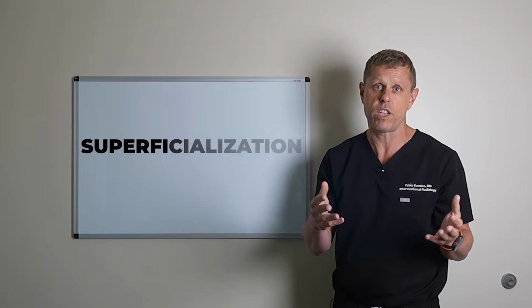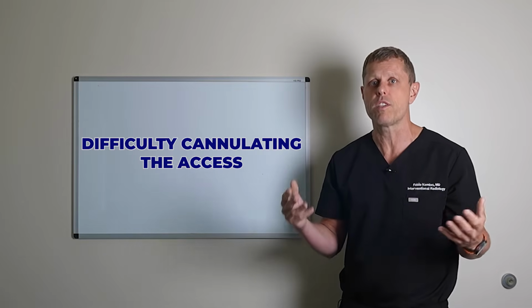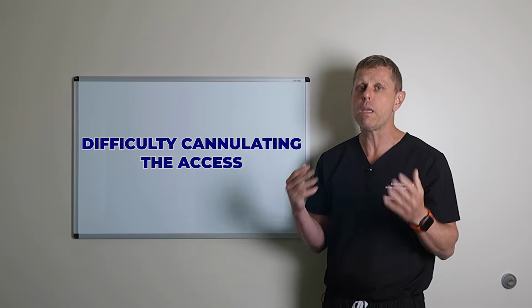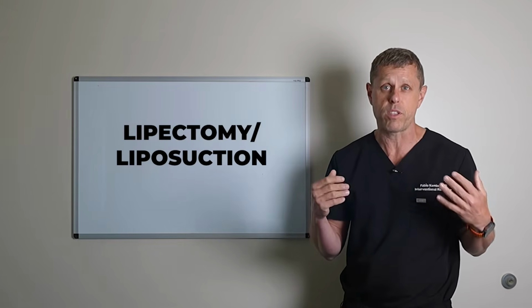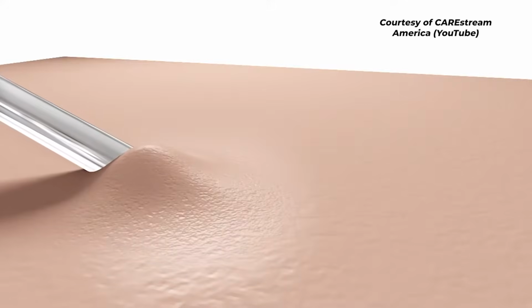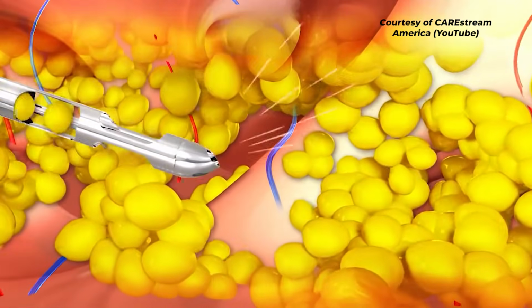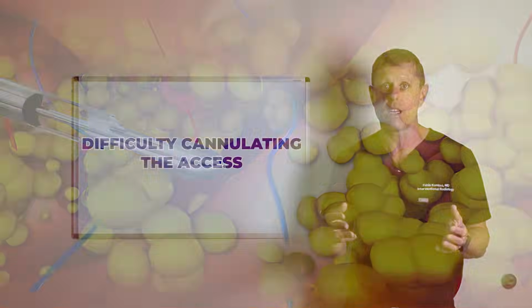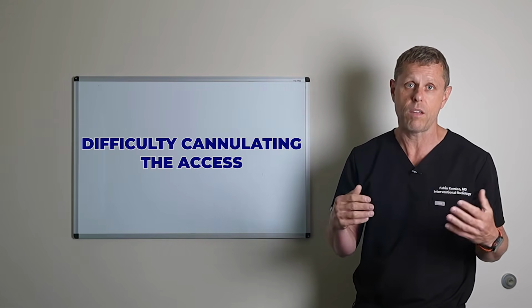It's called superficialization. And that is a procedure that can work, but involves a large incision.